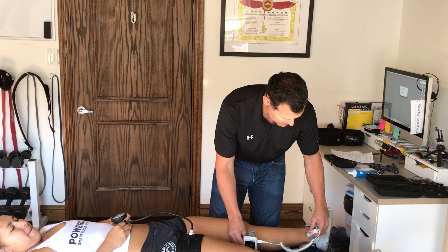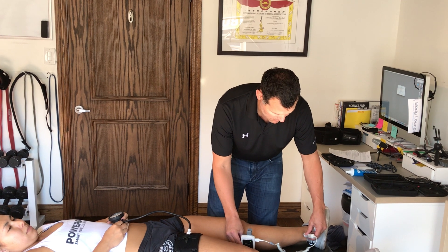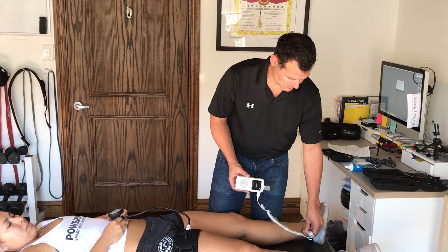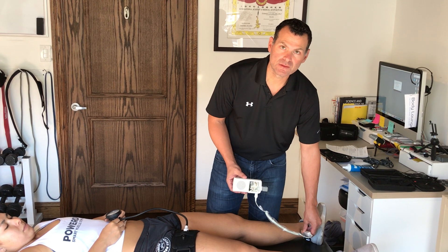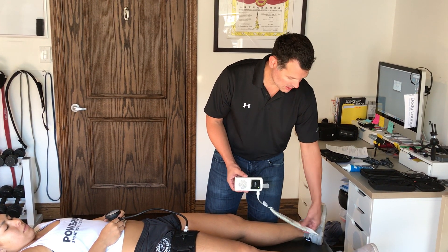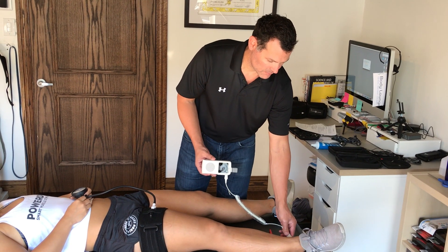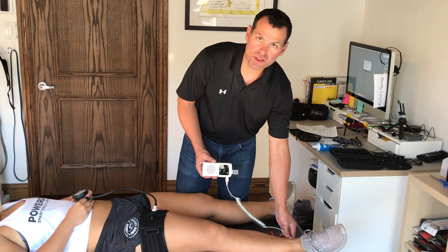Now I'm going to find the pulse on this leg so you can see what I'm doing. Then I'm going to do it on the other leg — I'll use the gel that I have — and you can hear the pulse there on both sides.